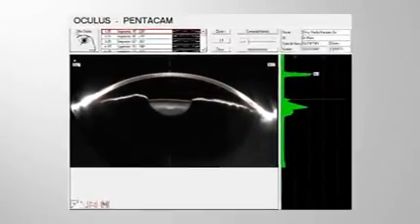Among PACD patients, and possibly with any other diffuse corneal opacities, Scheimpflug readings must be used with caution for IOL power calculations. And so, whenever new technologies arise, surgeons must be aware that new error sources may come along.